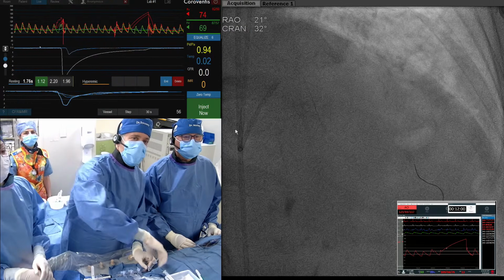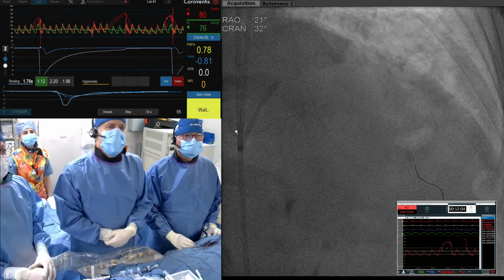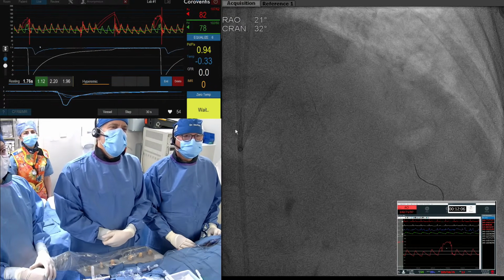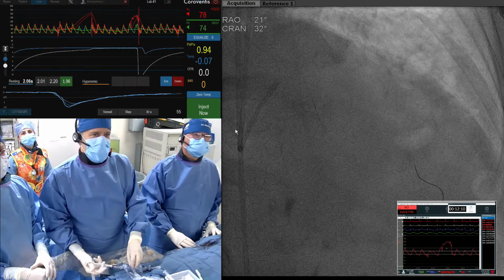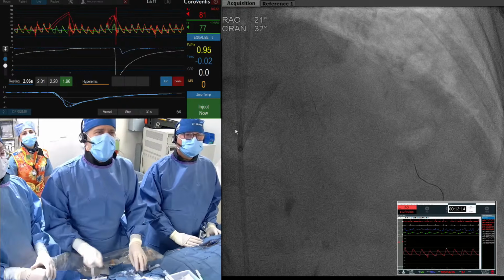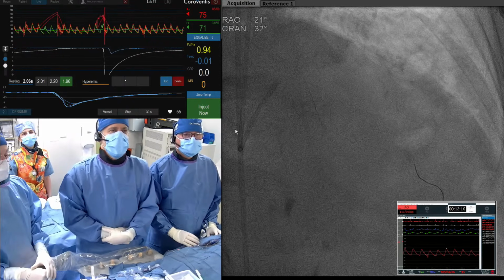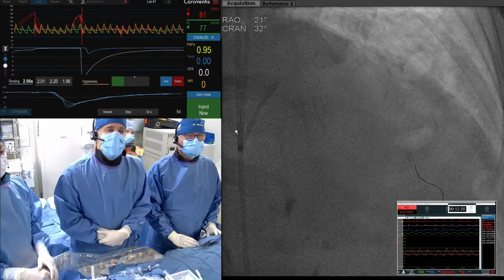So my temperature is now back to 0. I'll displace 3 cc's as quick as I can. Okay, and we'll get rid of the 1.96. Those are pretty good curves. I'm actually quite pleased. Those are great curves. Yeah. So why don't we take them? We'll take those. They're within 10%. That's perfect. Exactly. So our resting transit time is 2 seconds.